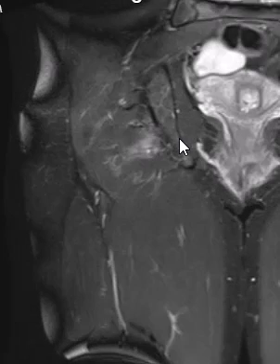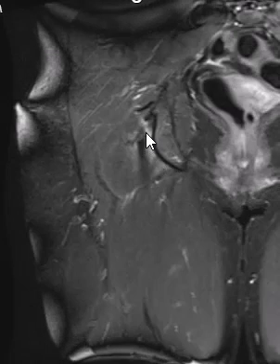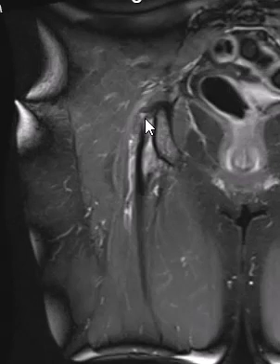On this coronal STIR sequence of the pelvis, this is the right thigh — the medial side and lateral side. We see the ischium coming down to the ischial tuberosity, and off the bottom of it we see the hamstring tendons. Here is one of the hamstring tendon components — this is the biceps.